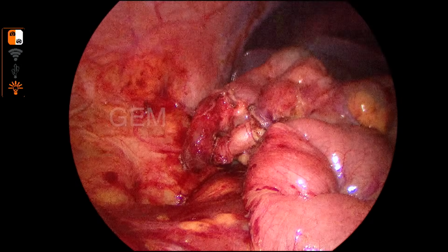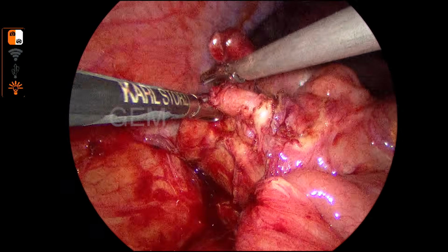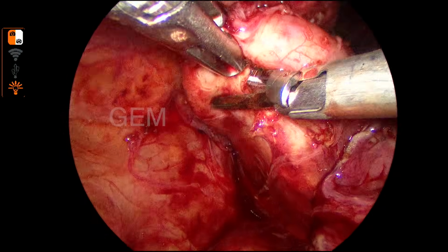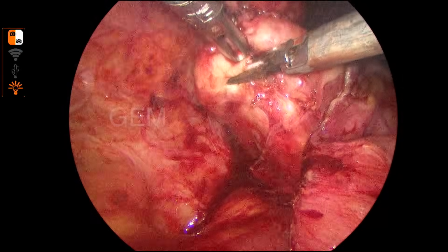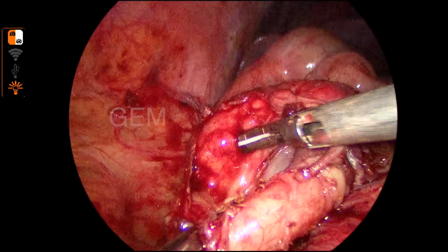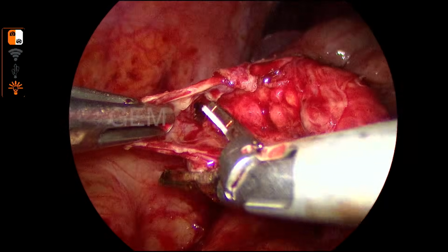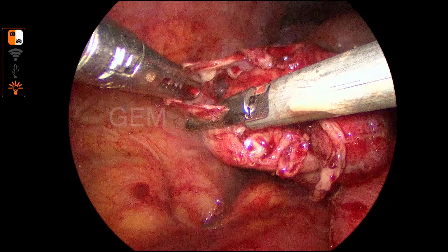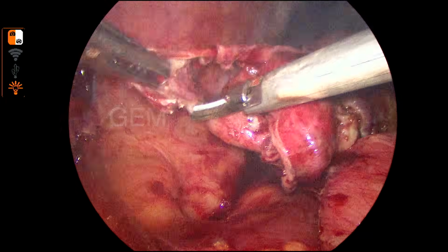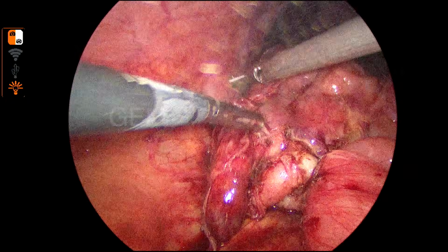So I can go close to the appendix so that I can straighten the appendix. Then I can identify the base. So now I am going close to the appendix, and the mesoappendix is also not to be excised, it is not recommended, unless you feel it is thick, edematous and part of it is gangrenous, then you excise. So this is the lateral attachment. I am dividing it.